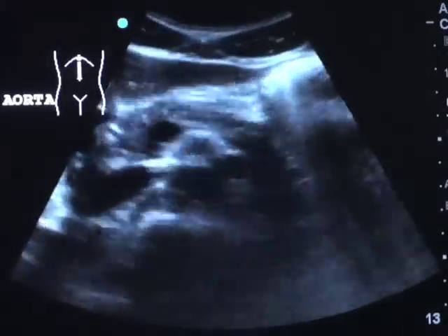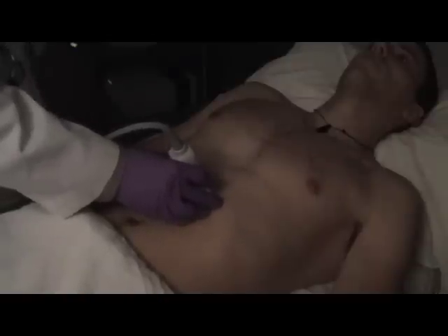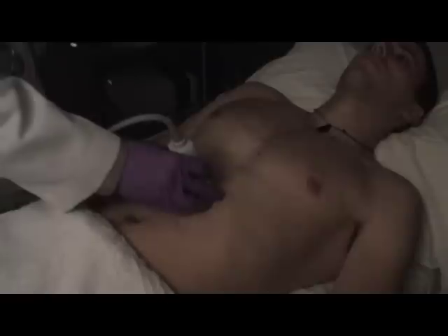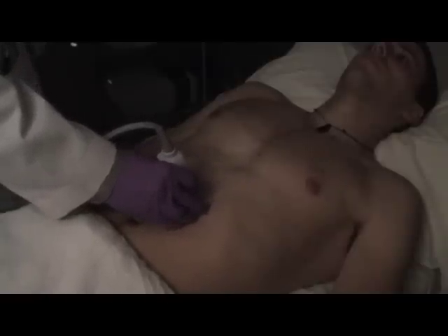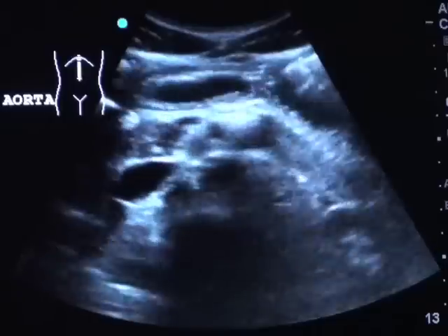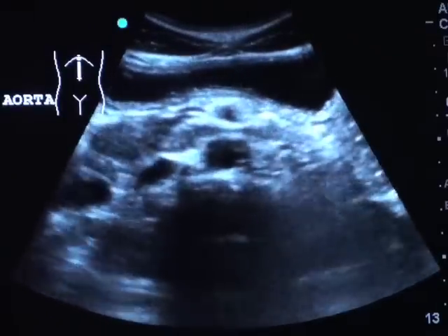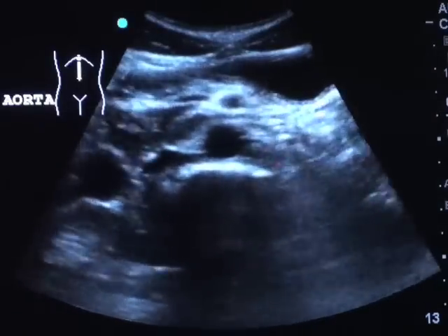Imaging initially the left lobe of the liver, and then walking down, trying to visualize the vertebral body as an acoustic window. Always, if there is a problem, use more gel, and try to use pressure on the probe to displace bowel gas laterally. Finding the vertebral body, which is going to be hyperechoic in the far field.